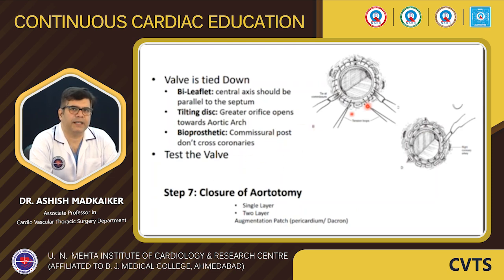Once the valve is seated inside, it is better to test the valve before we tie all the stitches, to see that there is no obstruction to the free opening of the valve. At the same time, there should be no tissue holding the valve between the valve and the annulus. So once we confirm, we tie all the stitches, whether it is a continuous or interrupted technique, we tie it and fix it, and then we close the aortotomy.